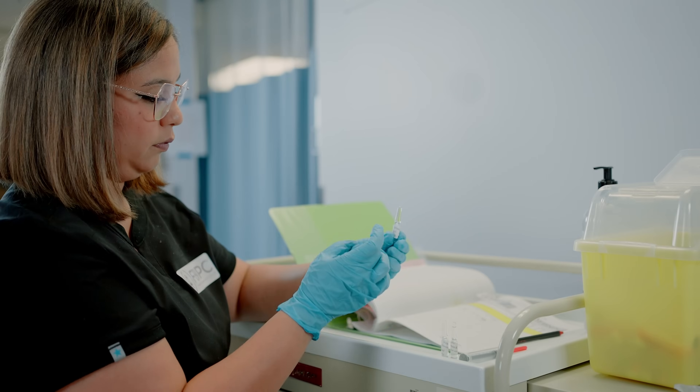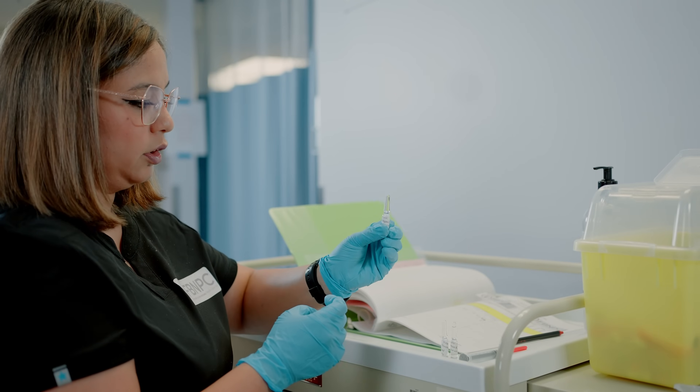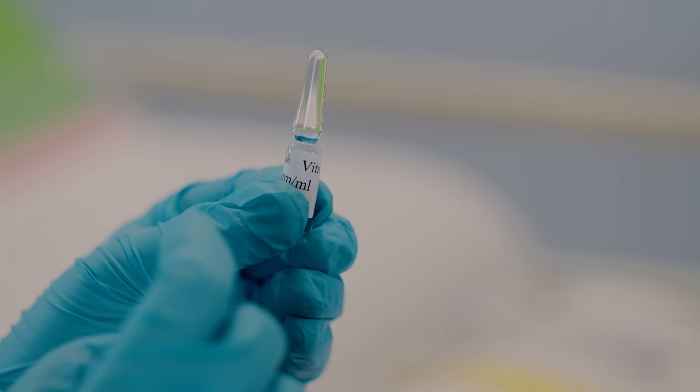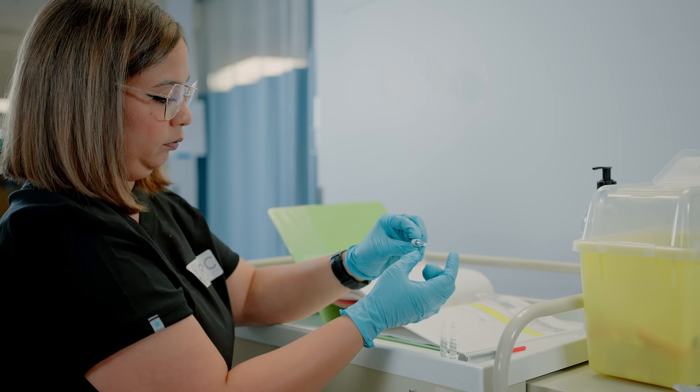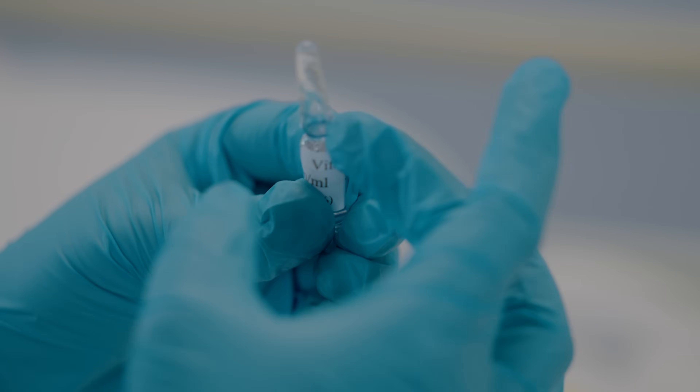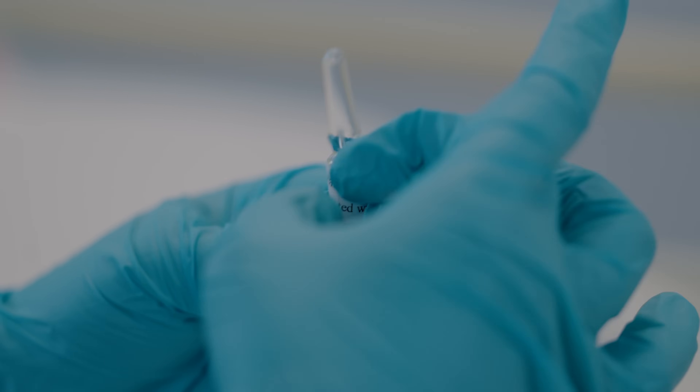Hold your ampoule in your non-dominant hand and make sure that you get all the air bubbles out of the top of the ampoule. You can flick it or gently tap the ampoule to make sure you are moving all the air bubbles out from the top.